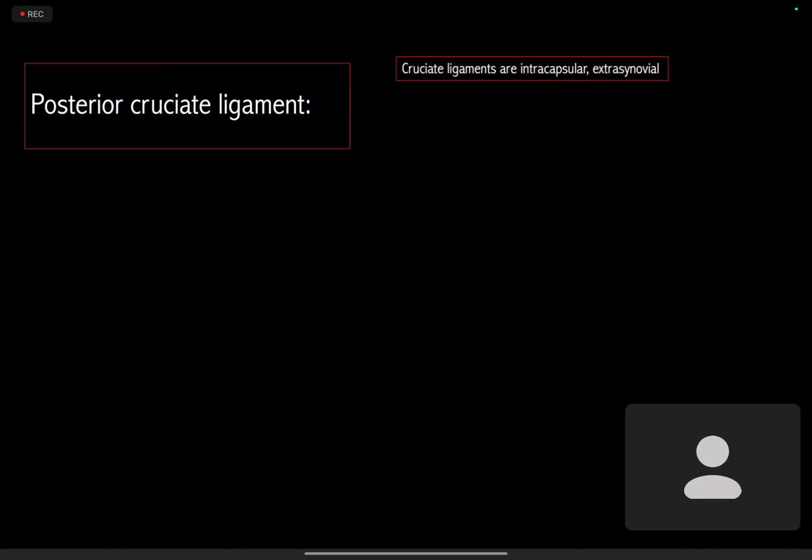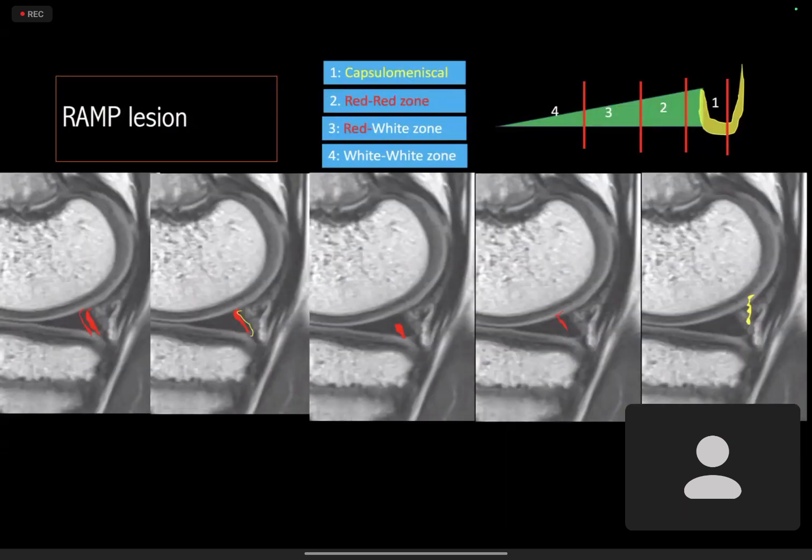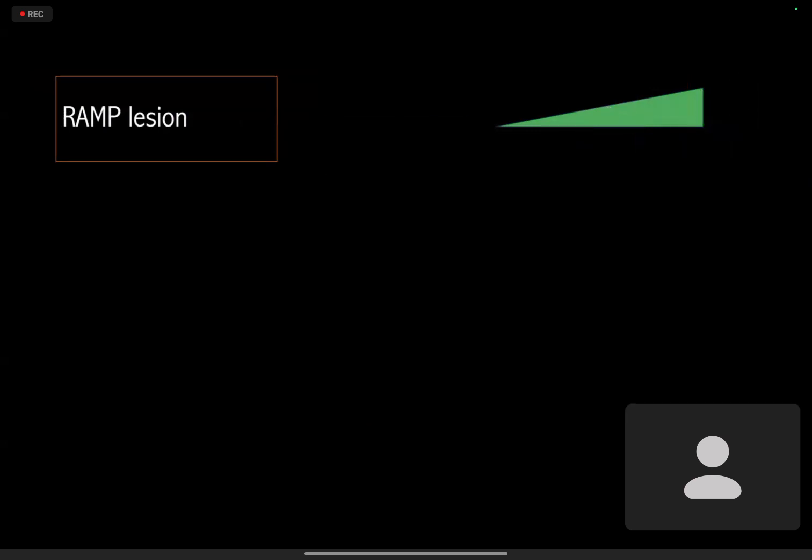Okay, just a last couple of requests. Can you please show the Kaplan fibers again? There's one more request. Yeah, I think the Kaplan fibers mainly.